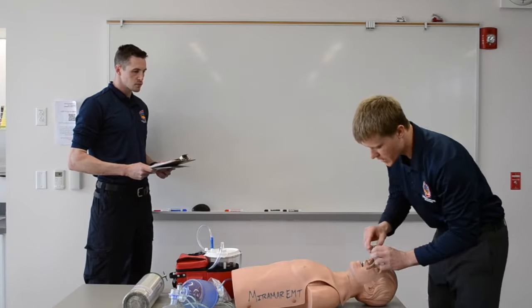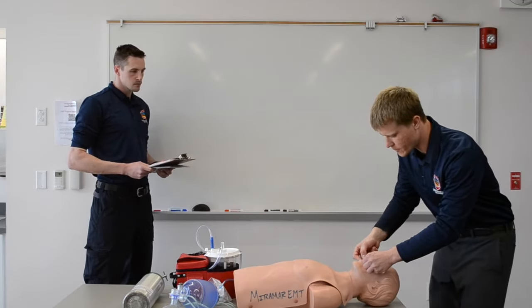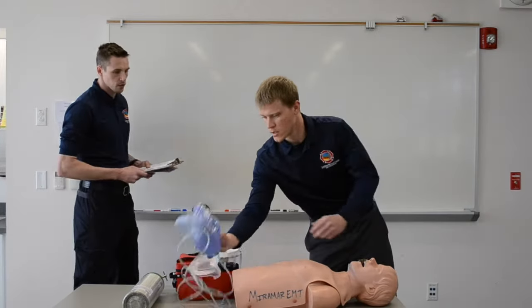Grab ourselves an OPA. Measure from the front teeth to the angle of the jaw. Cross-finger technique, 180 degrees — feel the transition from the hard palate to the soft palate, then rotate. No gag reflex is present and the patient accepts the airway adjunct.